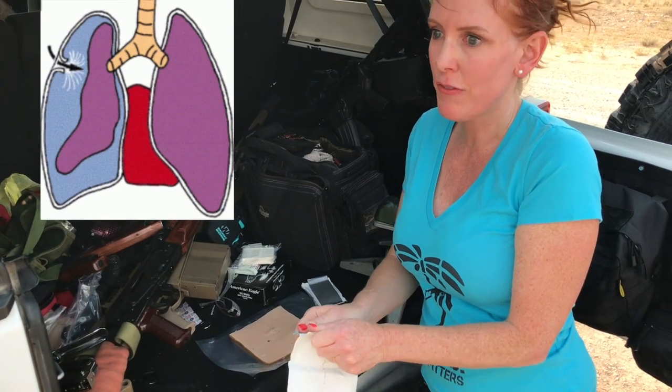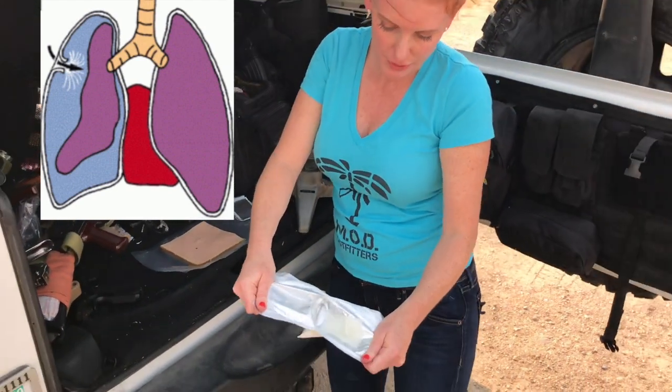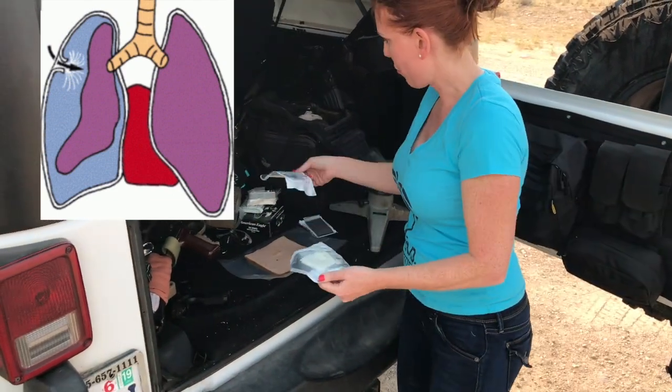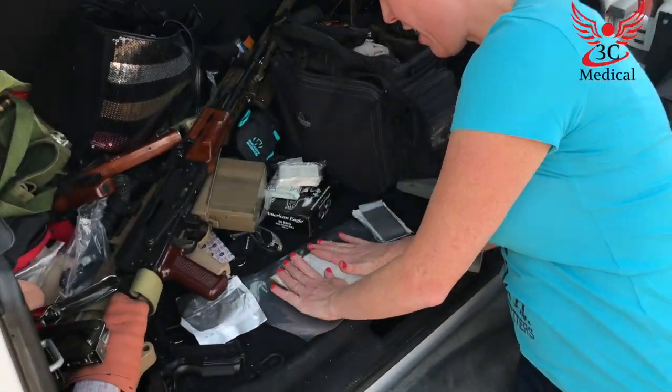We're trying to prevent air from getting in and further collapsing the lung. It's got Vaseline gauze in here, but the package itself is also occlusive. In this case we have small wounds and they'll both be covered by this one dressing, so we put that down.